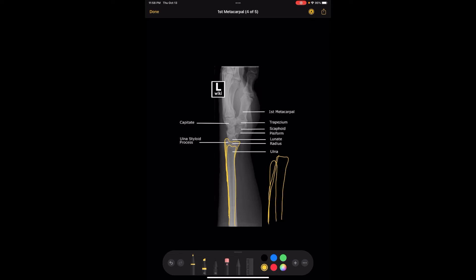You also want all the metacarpals to be as superimposed on each other as possible — you can see they're basically totally superimposed here. The lateral view is really so that you can see any dislocation anteriorly or posteriorly. You also want to make sure that the thumb is out of the way and not overlapping the rest of the metacarpals. So that is the image evaluation of the lateral view of the wrist.